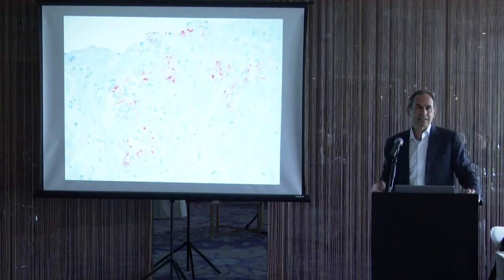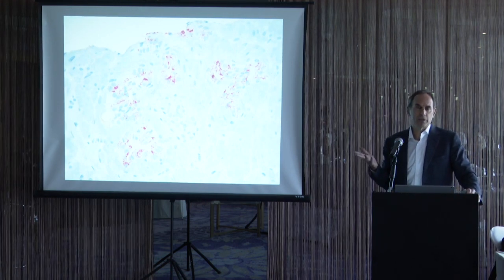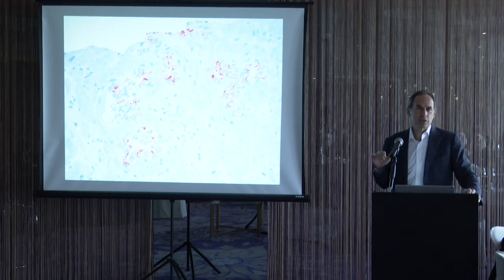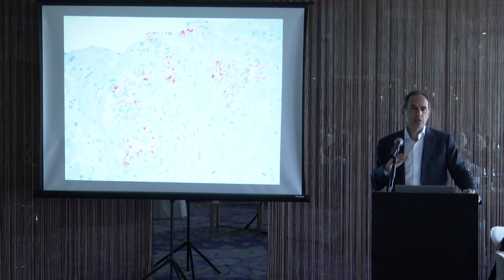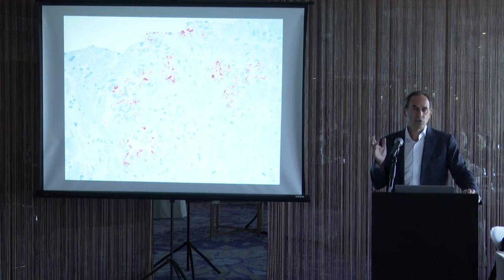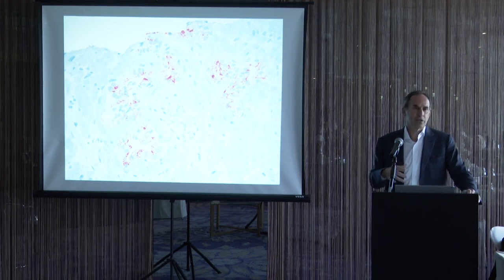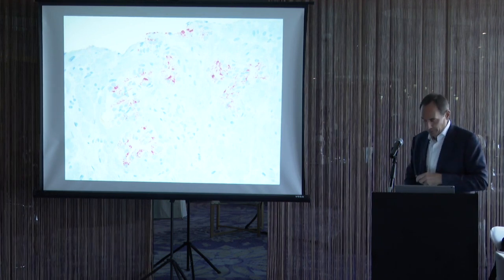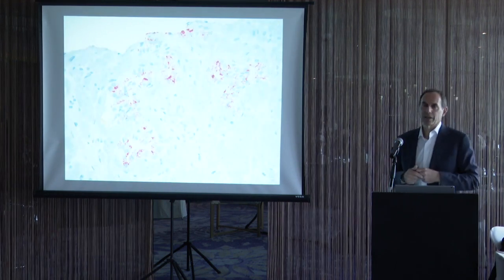But if you look at this, it stains basically indistinguishable from prostate cancer. No basal cells, positive racemase. So if you relied on the stains by itself, you would end up with a misdiagnosis. That's why with prostate pathology, 95% of the diagnosis is the H&E. Your special stains can be adjuncts, but if you use your special stains out of proportion to the H&E, you will make a misdiagnosis occasionally. So basically, again, in this case, I wouldn't have done the stains, but if you do the stains and you get this, you still don't call it cancer.